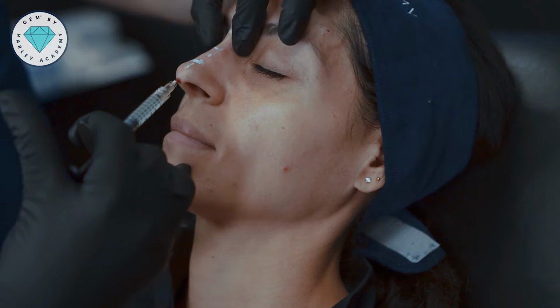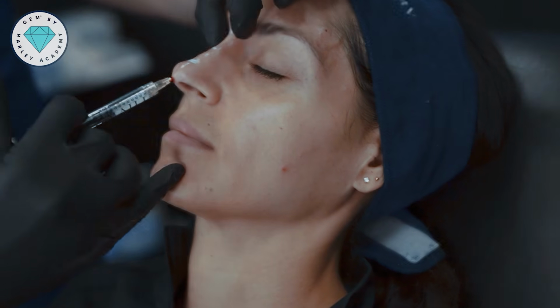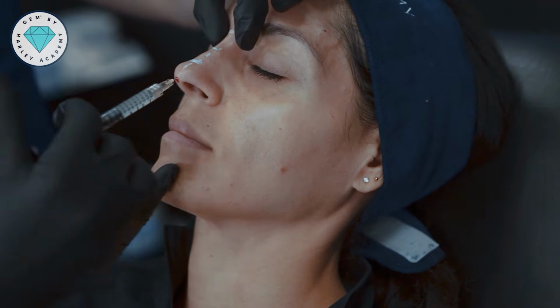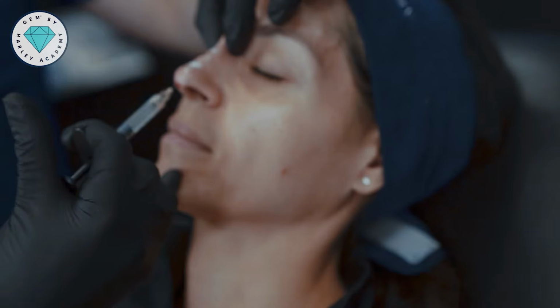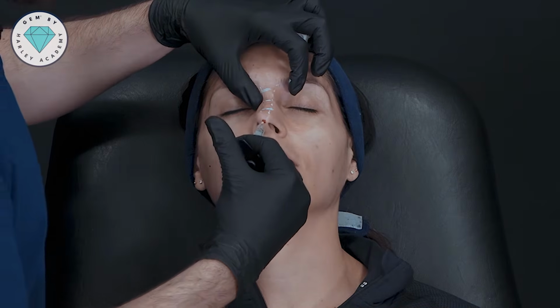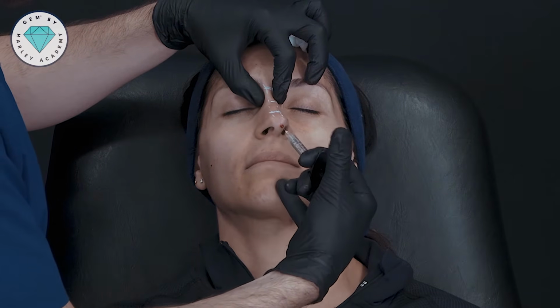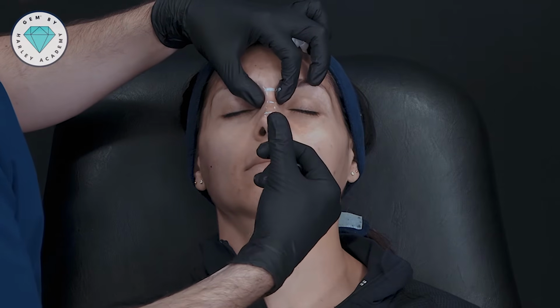Great. We're using Miley Extreme here, so this is the most projecting hyaluronic acid in the Sinclair Miley range. It's very suitable for nose, where we're trying to mimic the very tough underlying structures of the bone and the cartilage. I suppose the other benefit of using a high G-prime product is you can use less of it, and in such a high-risk area, the less product you can use, the better.